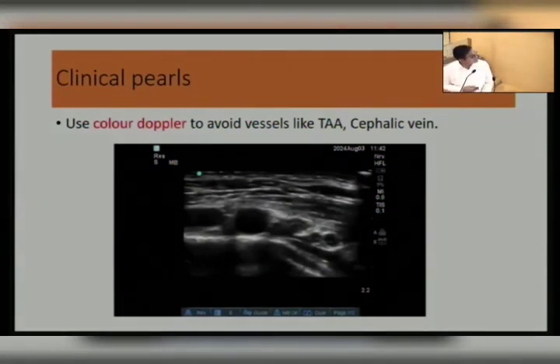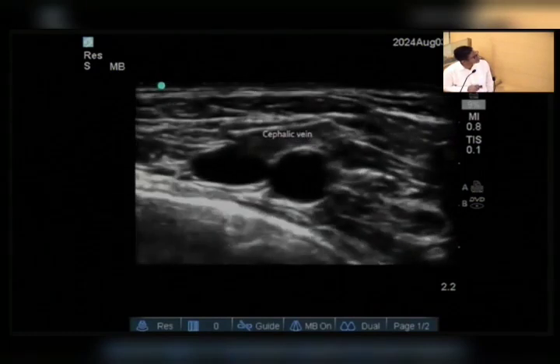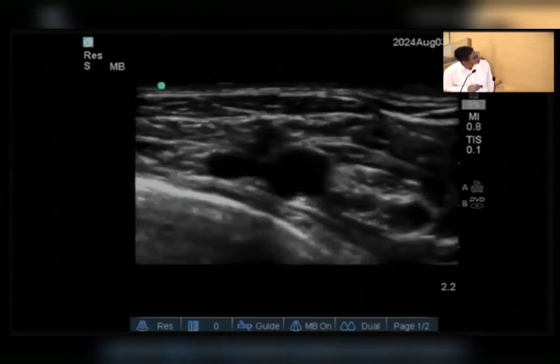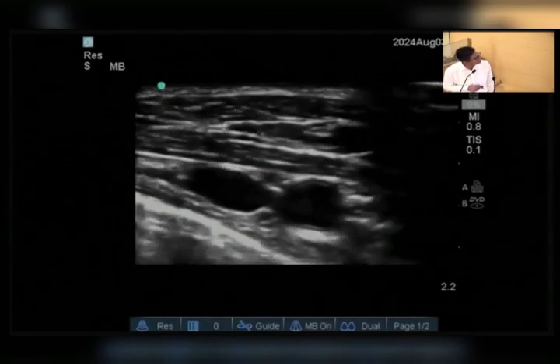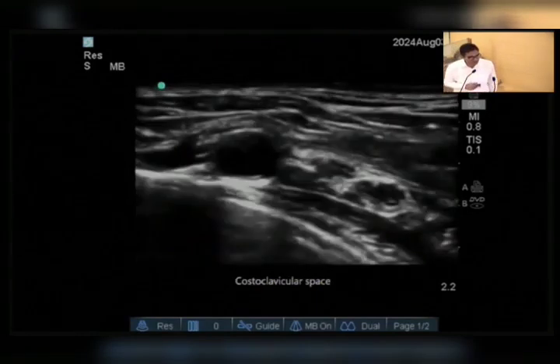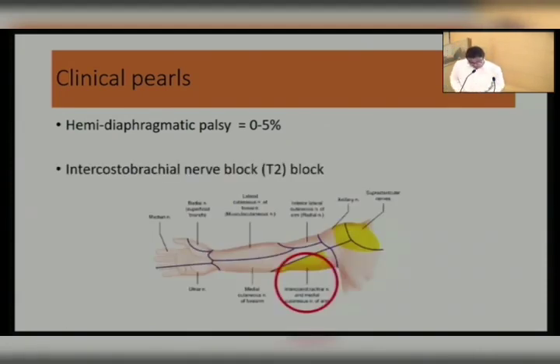Some clinical pearls: the vessels are normally there, that is the thoracoacromial artery and cephalic vein. See, this is artery, vein, the cephalic vein entering over the subclavian vessels over here, and some branches of the thoracoacromial artery are arising from the subclavian artery. So vessels are normally there, you just have to avoid these vessels during your needling. Hemidiaphragmatic palsy is almost 0 to 5%. Few researchers say it is almost 0%, few say 5. Still we need some more research to get proper data. And here also, in a few cases we require an intercostobrachial nerve block depending on the type of surgery.